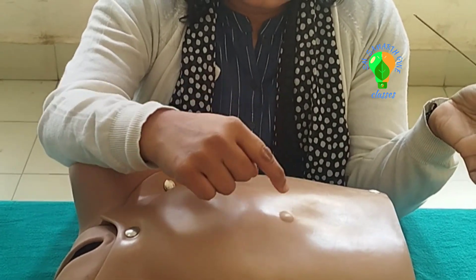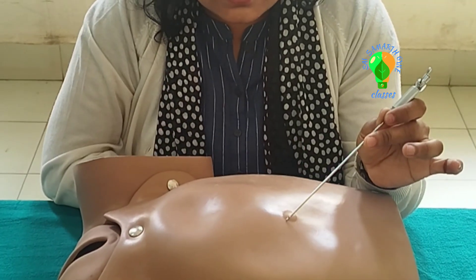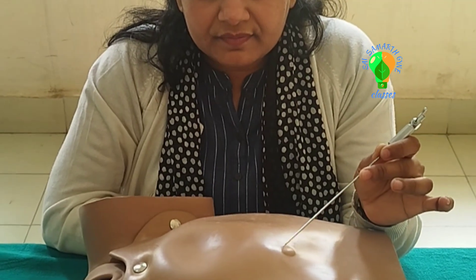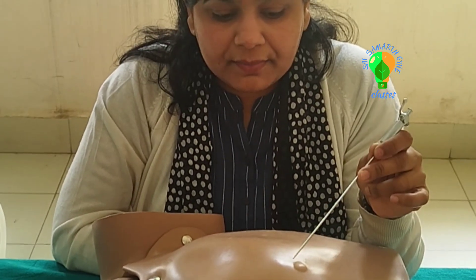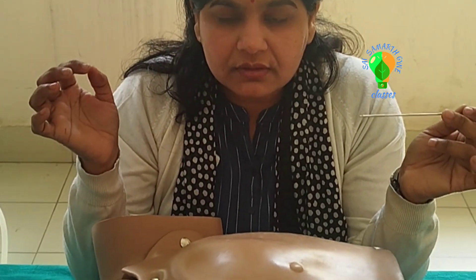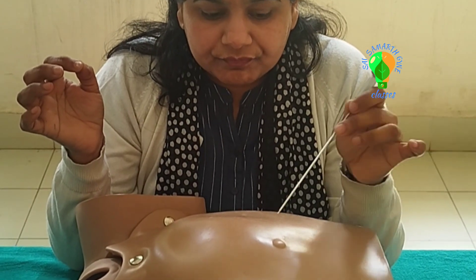For demonstration, this is the umbilicus. This is the inferior crease of the umbilicus. We give a stab incision here through a scalpel — a very small 3 mm stab incision into the inferior crease of the umbilicus.